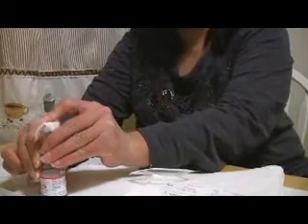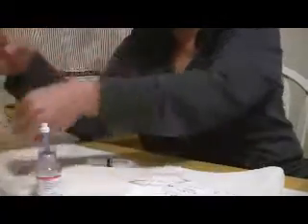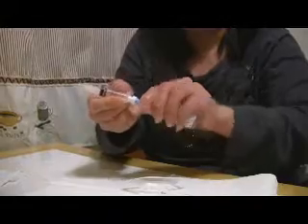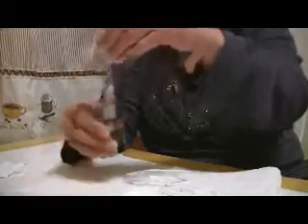Before we take out the Remodulin, we do need to clean off the top. Since this has been in the refrigerator, we don't want any bacteria on it. Then we just gently screw on the syringe and push it down, let that release so we can draw it back.